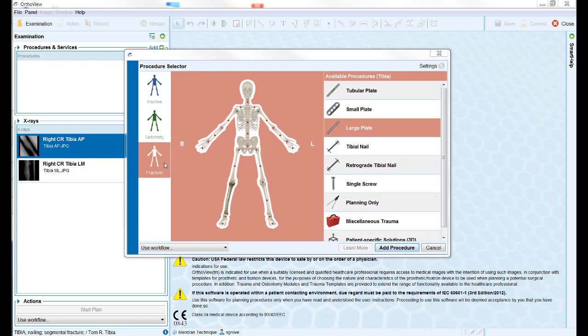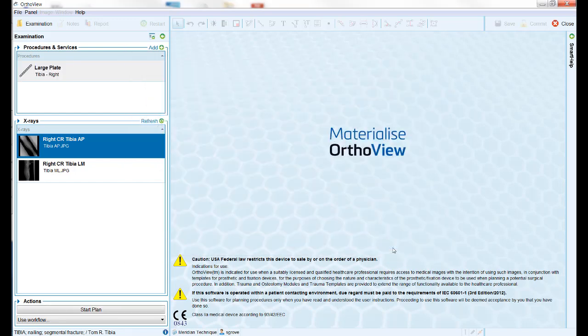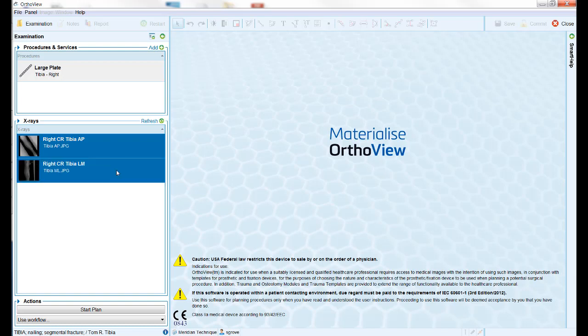For this tutorial, we will select the right tibia and finally the large plate option. After clicking add procedure, use the control key on the keyboard to select both the AP and lateral views on the left of the screen and click start plan to move to the scaling.